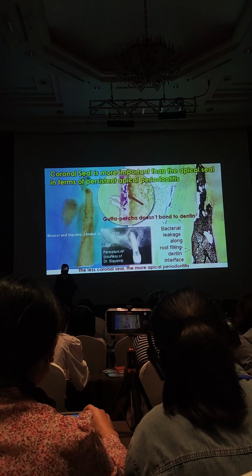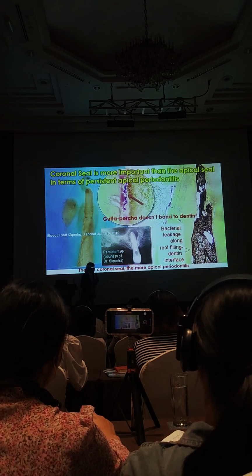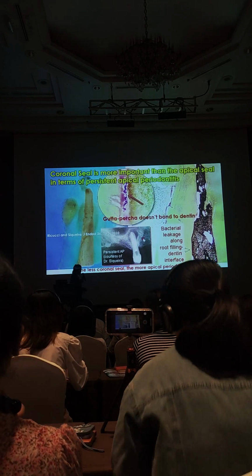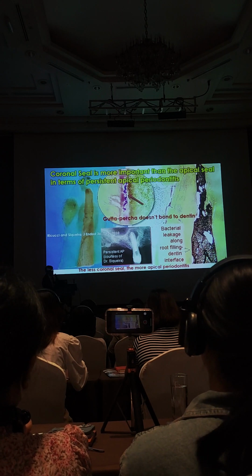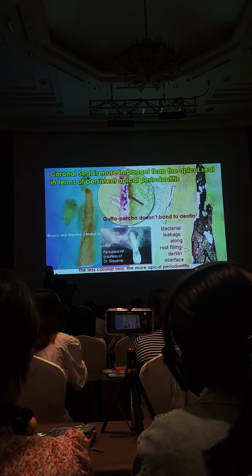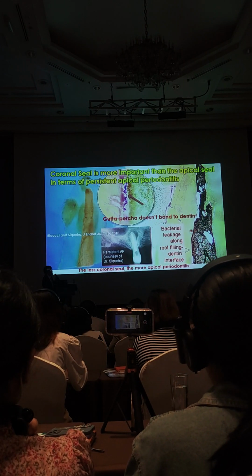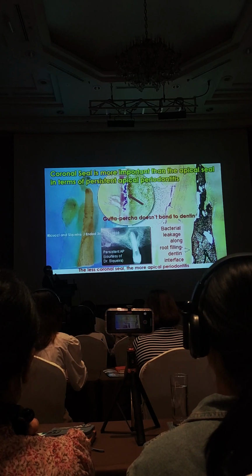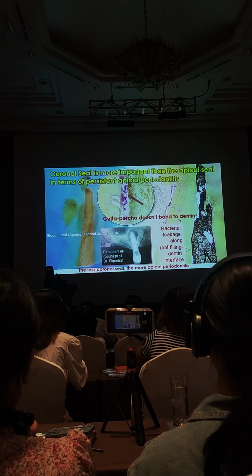And this will bring up another issue. If you obturate the canal with gutta-percha and a sealer, this is again a study done by Dr. Domenico Ricucci in Italy. He showed all the cases allowed bacterial leakage, coronal leakage, if you didn't place the crown, as long as you use gutta-percha and sealer. Look at them.